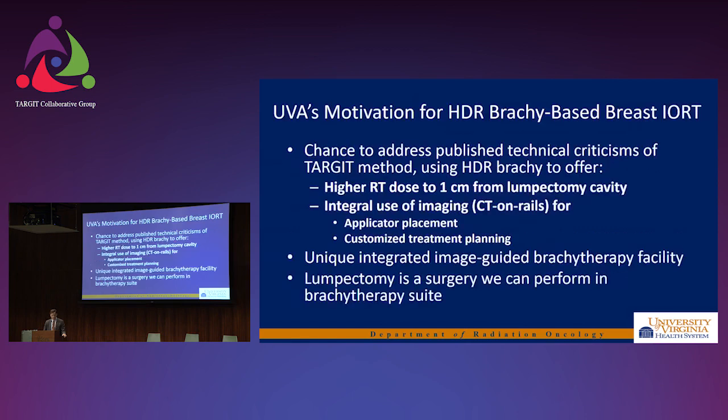So our rationale, or motivation, for doing brachytherapy-based breast IORT, as you think about that time, like 2012, the reaction was ongoing for the TARGIT-A trial. We knew we had this unique integrated image-guided brachytherapy facility where we can essentially use APBI techniques, like a single-entry balloon applicator in standard CT planning, and leverage that to offer our form of IORT.